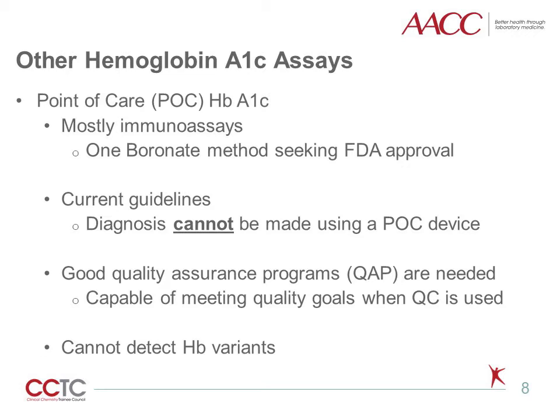To rectify this, laboratories that manage point-of-care programs and clinical offices utilizing point-of-care devices should instate certified non-manufacturer quality assurance programs in order to optimize the performance of their analyzers. Recent data has shown that point-of-care devices such as the Afinion and DCA models are capable of meeting QAP goals for trueness and imprecision when QC is utilized as it would be in a laboratory setting. Monitoring of known diabetic patients without hemoglobin variants can be done with point-of-care devices once a diagnosis has been established.